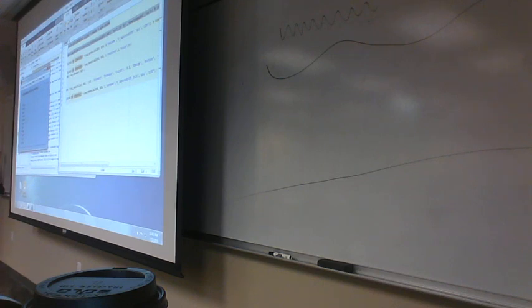We would have to connect them. It would look like this. Does that accurately represent the brain activity that was happening then? No. You're sampling way too low, right? What you want to do is sample at all these different times, right? That way when you plot that data, it actually represents all that. You guys follow the logic?